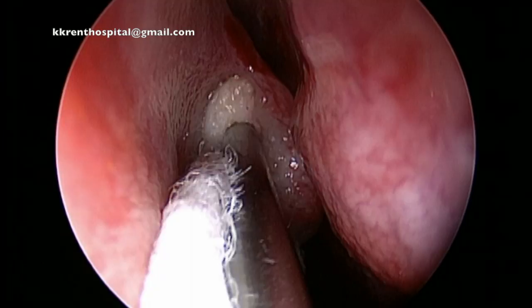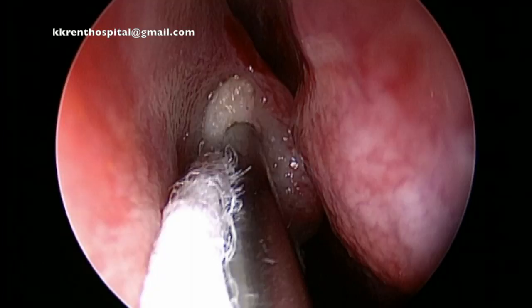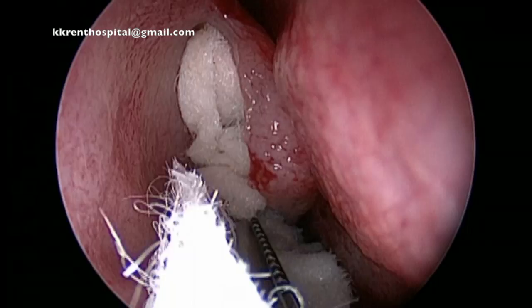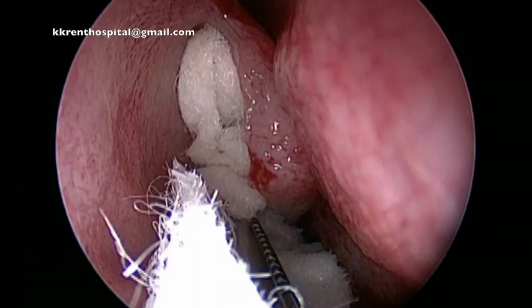a gentle packing is done in the middle meatus. Remember, in the previous video I have already packed the skull base, which is the area between the turbinate and the septum. The packing is gentle — you don't want to cause any damage to the thin mucosa and start bleeding. Bleeding at this site would be troublesome throughout the length of the operation.